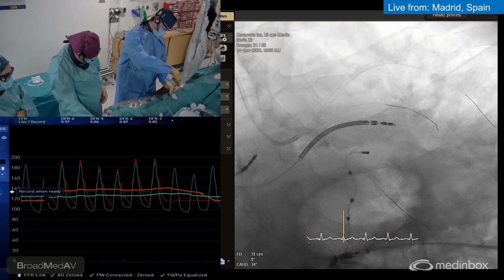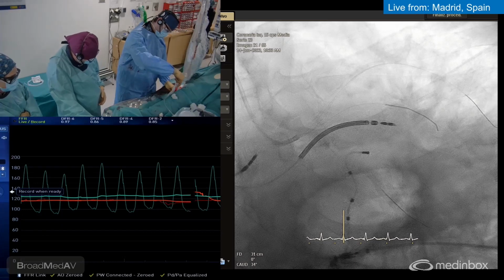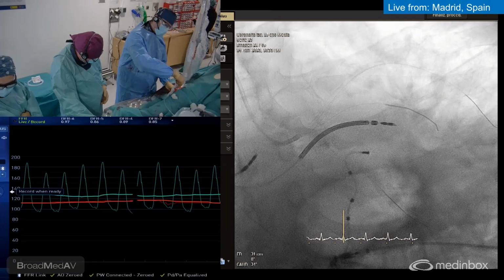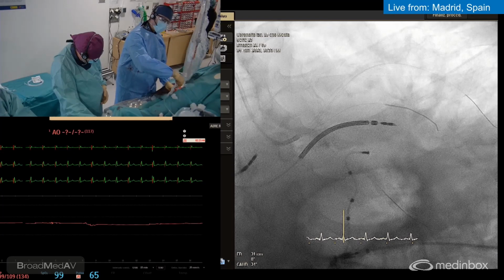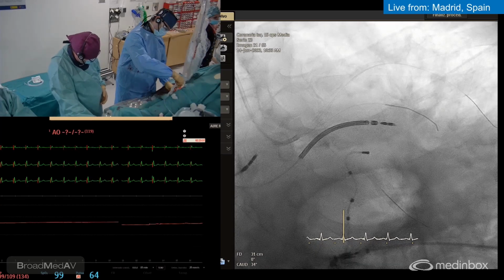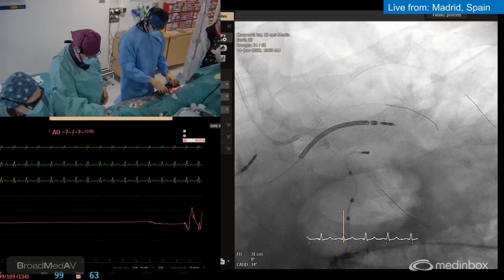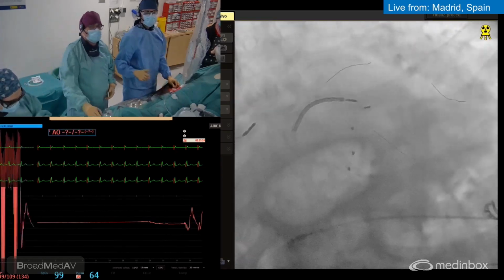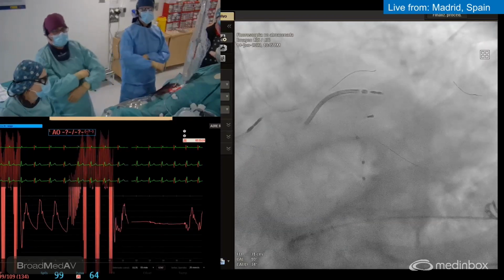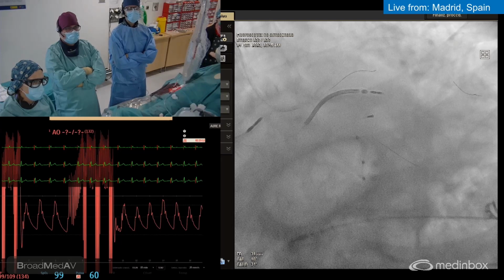Let's watch the EKG. I'm going to start. There's some bubbles here. Okay. Slowly. 60 micrograms. Look at the ECG and the pressure. 120. I think 200 is okay. Washing? Water, yeah. A little bit more, please. Okay. Let's check. Okay, I think we can measure now.